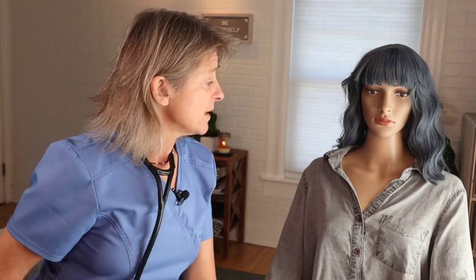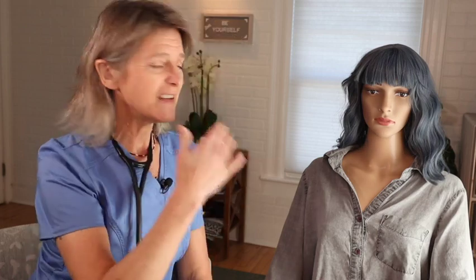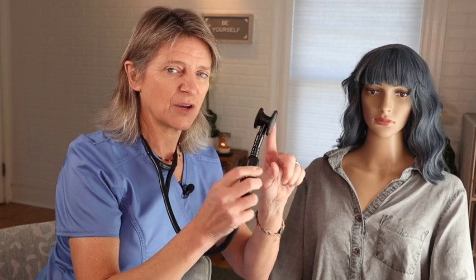Now, most of my patients in my clinical setting and where I work do not change into gowns, so this is perfectly appropriate. Some offices, you can have the patient change into a gown, and that would be cool. But Jade's just going to stay with the shirt, just like this. And we have the CORE digital stethoscope right here.